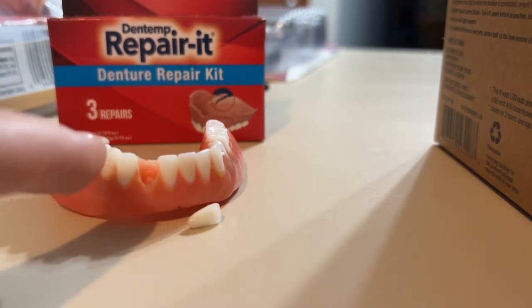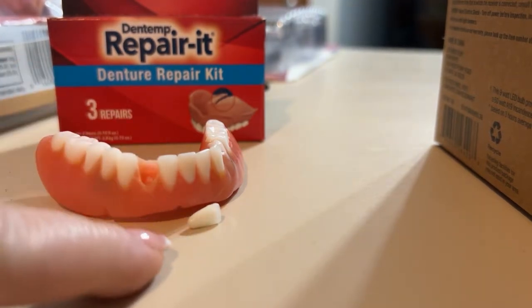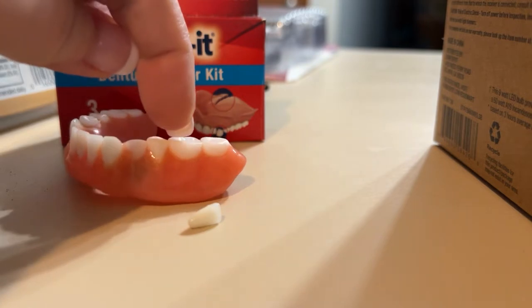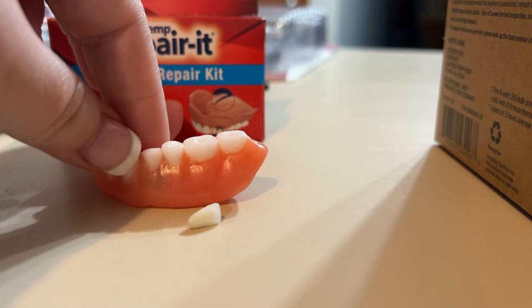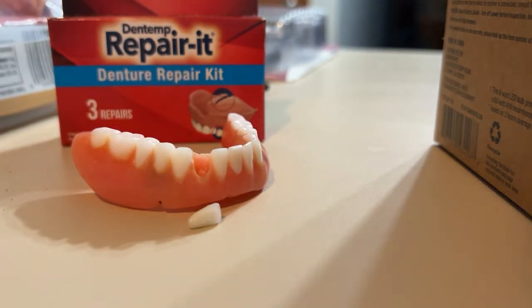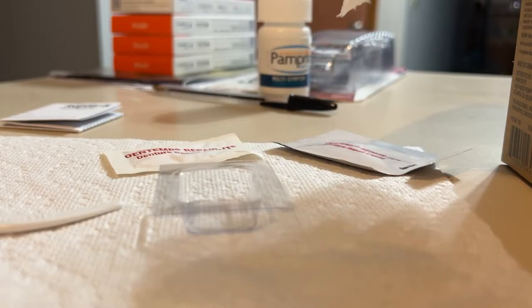We will jump right back — a jump skip, that's what we used to call that — after that's done, and I will show you how to use this to take care of this problem quite permanently, I might add, because this one has already been done with it. Six months later I've had no issues. Not only that, but the last time this was in for repair, my dentist and the lab techs at Affordable Dentures did not notice that there was a repair that had been done that they did not do, and they honored my warranty anyway.